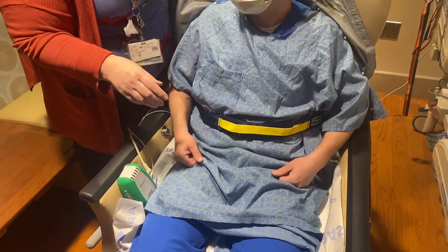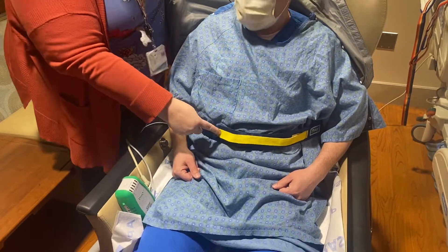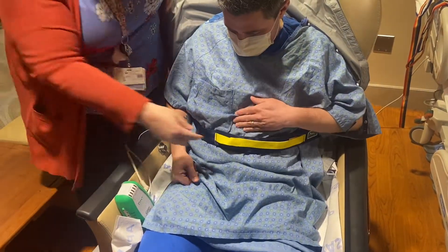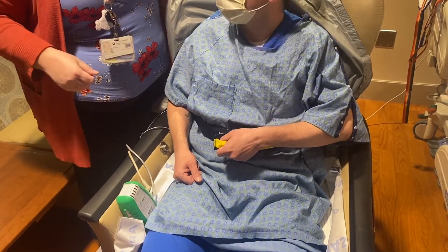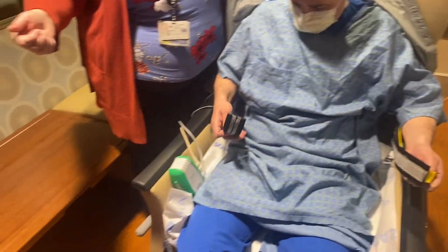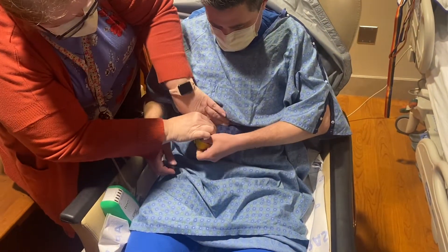Yup, it sticks together. So now if there was an emergency, like there was a fire in the room and you had to get out quick, are you able to pull that away? Grab this yellow strap and pull that. Right now? Yup, pull it right now. Very good. So you know how to use it. Let's put this back together. Perfect.